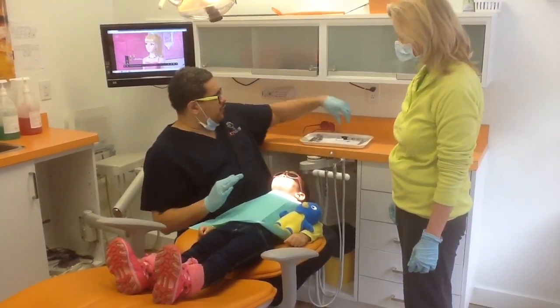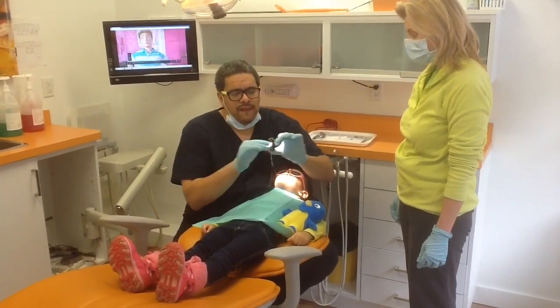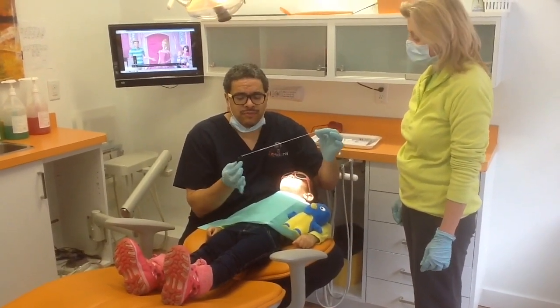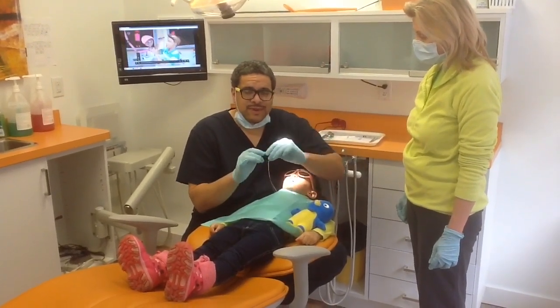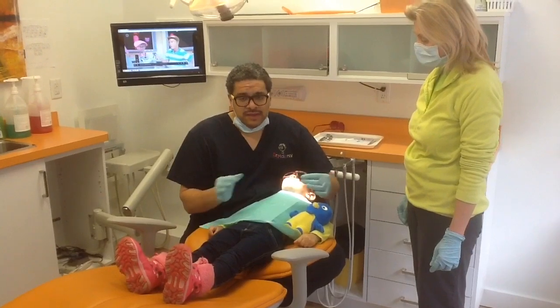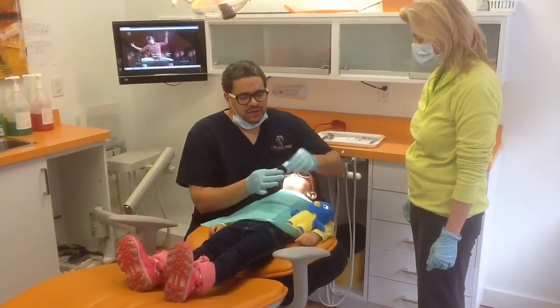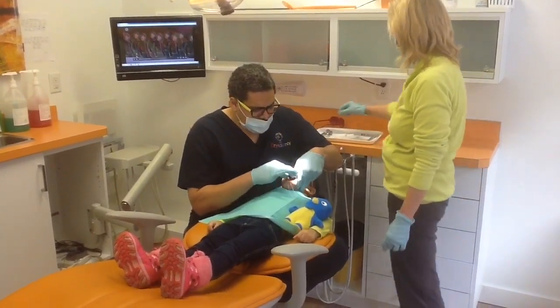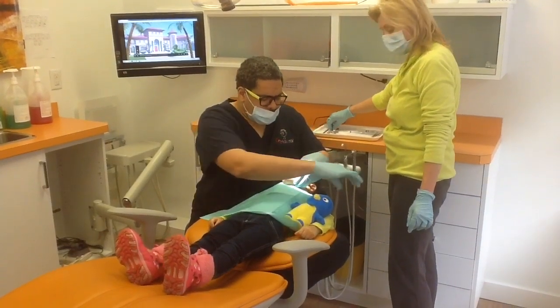The first thing we're going to do is put a little rubber bite block in the mouth. Of course, anything that goes in the mouth, we try to put a little floss on it — a very long floss — just in case we have to grab it in an emergency. Especially with uncooperative children, anything in the mouth can be a potential choking hazard. So we're going to place this in real quickly and gently.